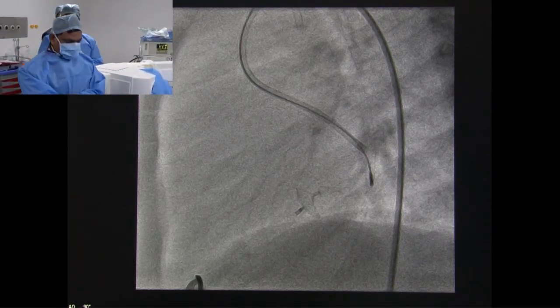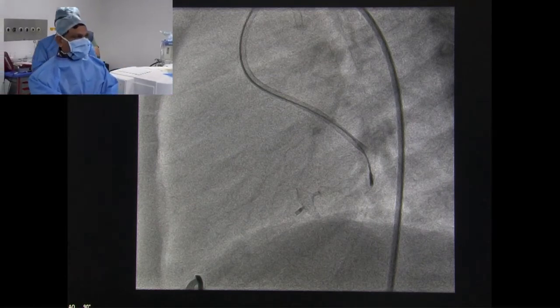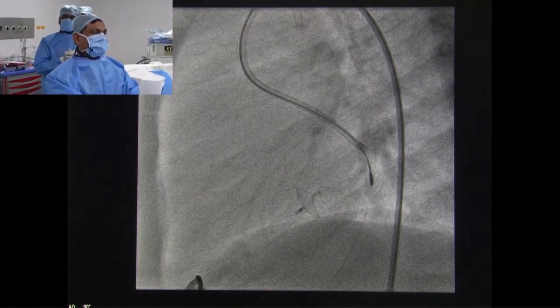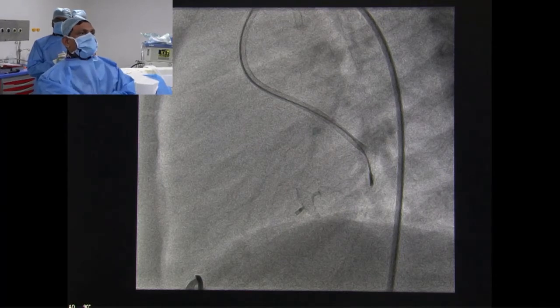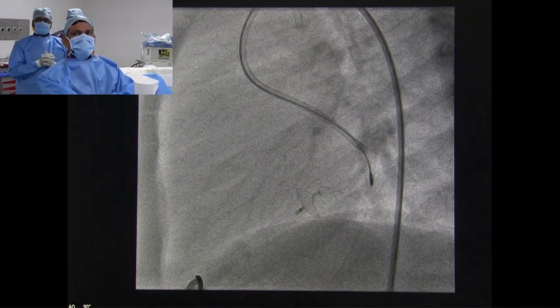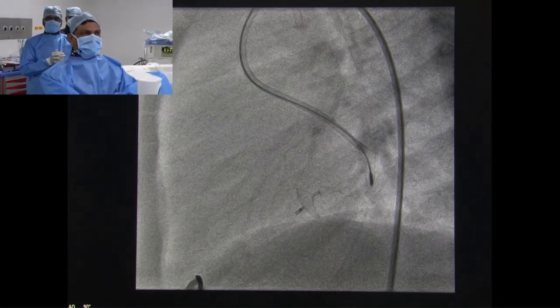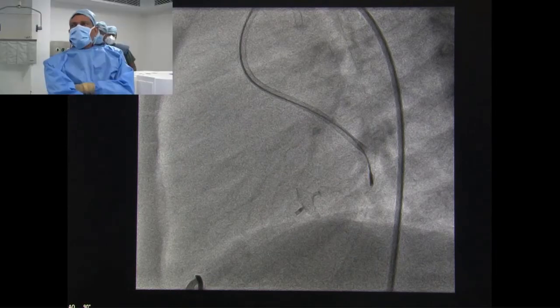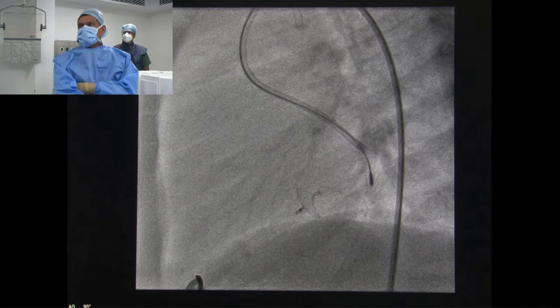Would something with a single disc work, like an ADO? Yeah, I would have personally used the ADO AVP4 in this situation because it's a little low profile. But I think that's fine. I think the choices are okay. We thought of the AVP4, but we did not consider it because embolization may be possible with high flow. I thought it is low profile.